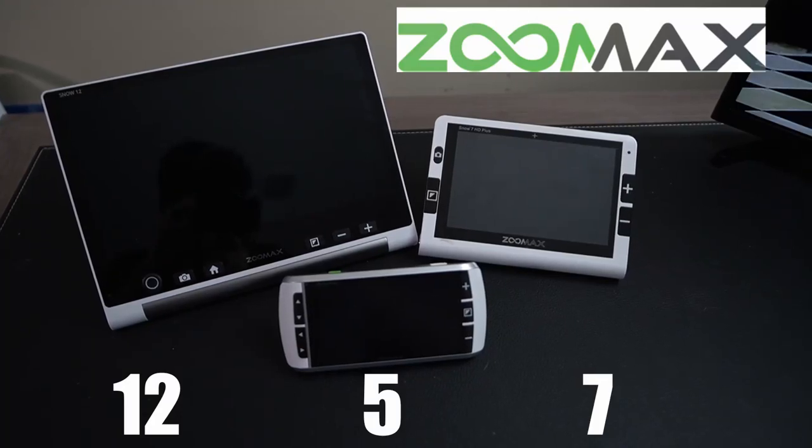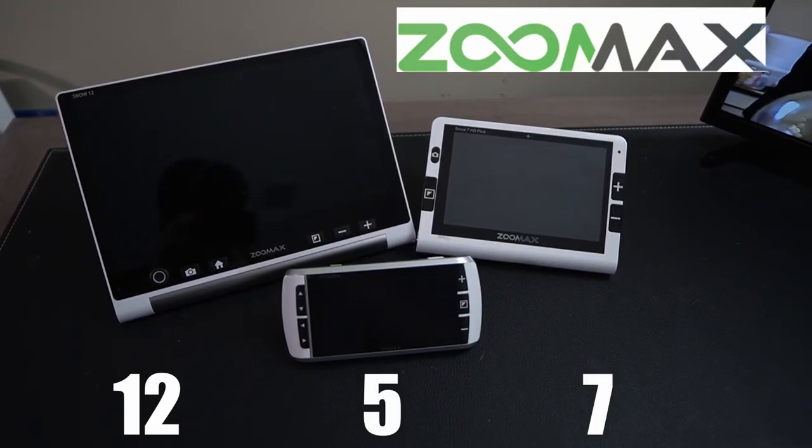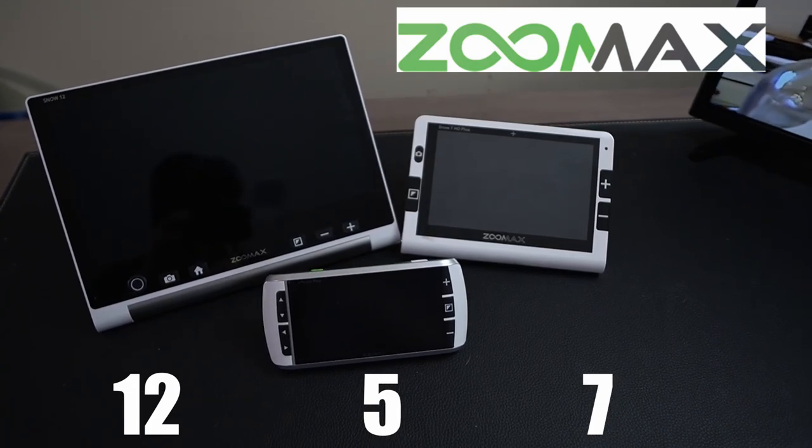Okay, with that being said, let's take a look at the complete family of Snow digital magnifiers. This line is brought to us by Zoom Max. You've got a 12-inch, 7-inch, 5-inch, and 4.3-inch. So there should be something for everybody. They're all very lightweight and they all feature full HD cameras and long battery life.